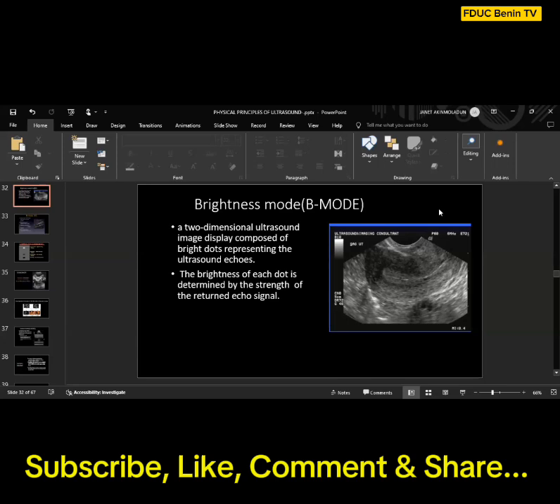We don't use Doppler in early pregnancy. Actually, I was telling you, I showed you the slide. Can you hear me? Yes, I'm hearing. Doppler ultrasound produces more heat. The thermal index is more.